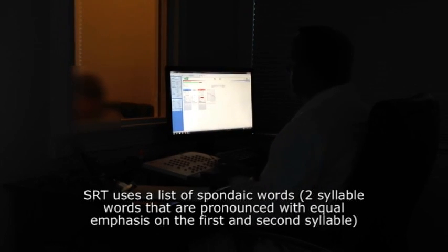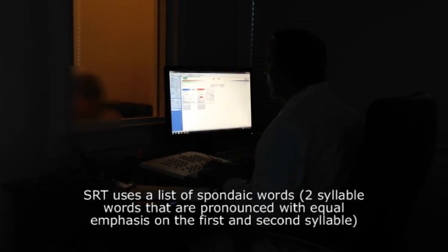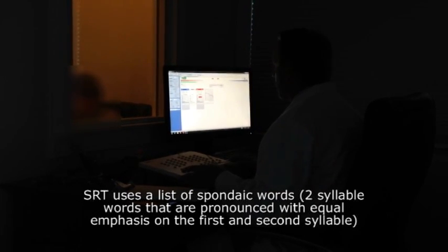Okay, I'm going to give you a list of words, and they're going to slowly get quieter and quieter. I just want you to repeat them back to me as long as you can hear and understand what they are.